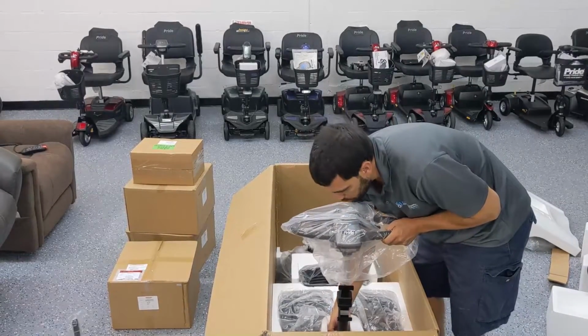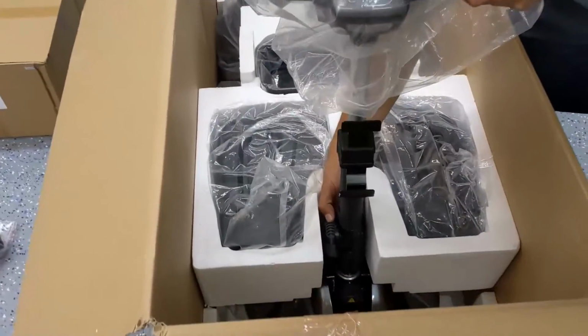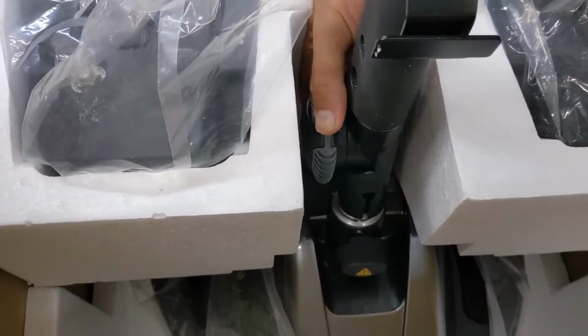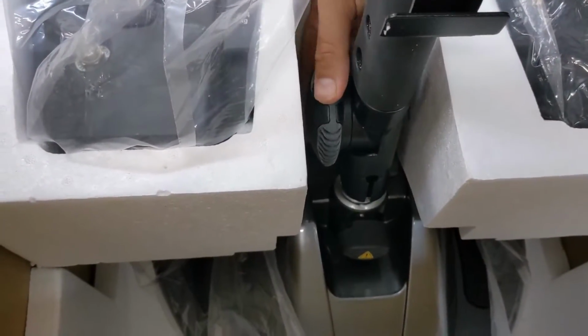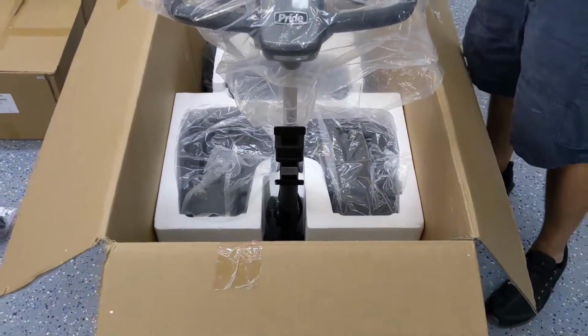And then if you kind of zoom in here, Dustin, with the camera to see the adjustment knob for the tiller to control how forward and back it is needs to be tightened. So now it's in place and locked in place. It's not going to swing around.